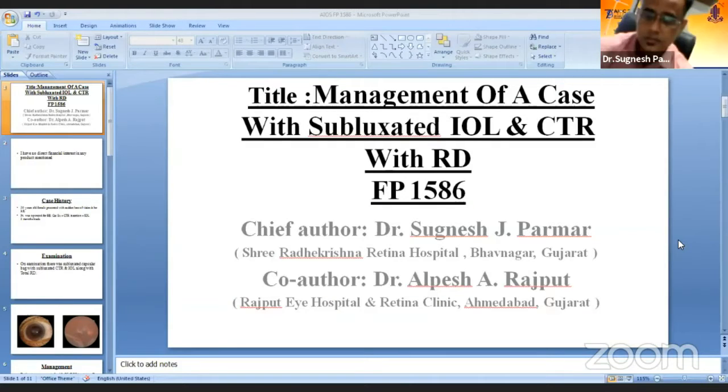Going to present a case. The case was with subluxated IOL and CTR, and was presented with total retinal detachment.